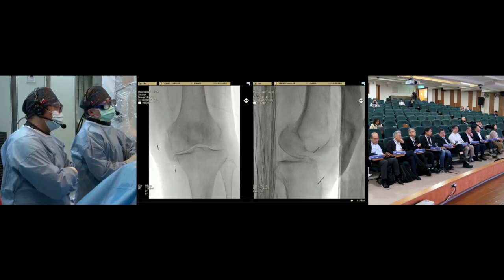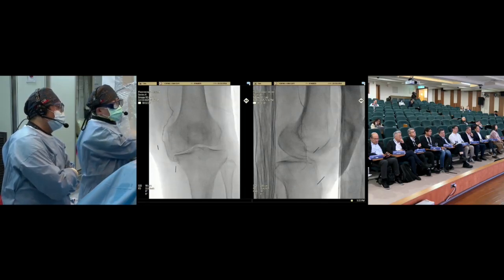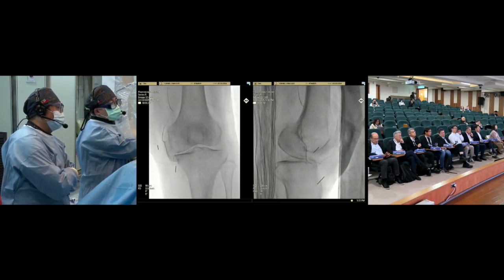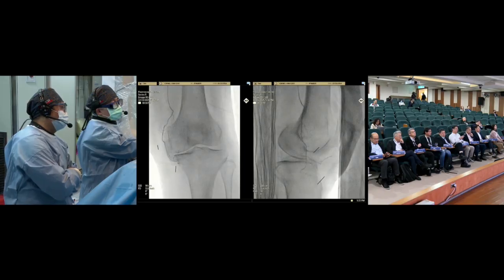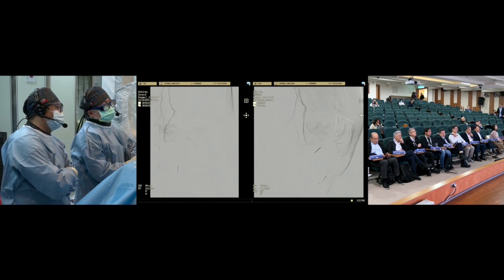The increment should be 0.5 cc, and we have given a total of 1.5 cc now. This is doing the embolization. After embolization, we do a follow-up angiogram to make sure that all the angiogenesis disappears. So this is the angiography after we did the embolization. You can see the angiogenesis over the knee joint disappeared.